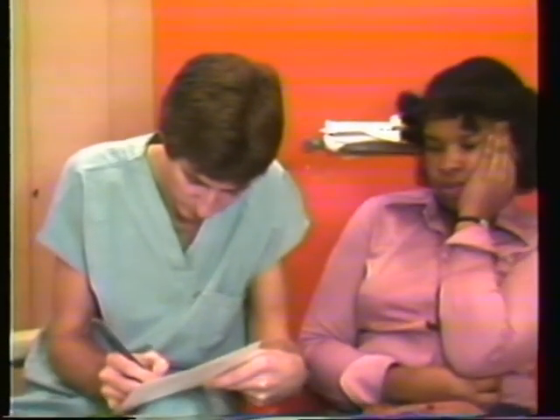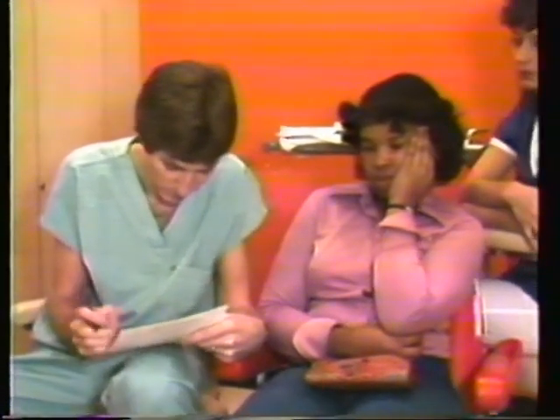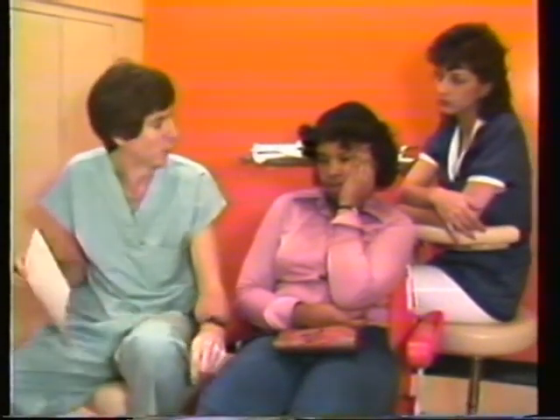By the way, I hope you noticed that the patient's chart indicated that tooth number 14 was to be removed, not tooth number 3 as described by the student.